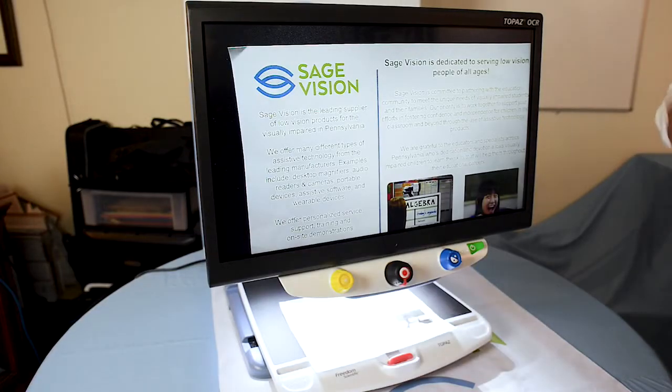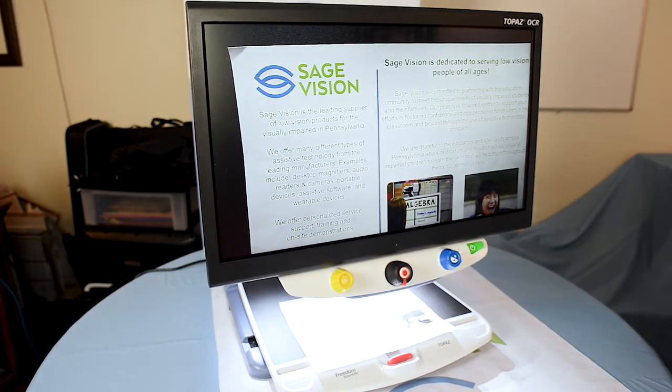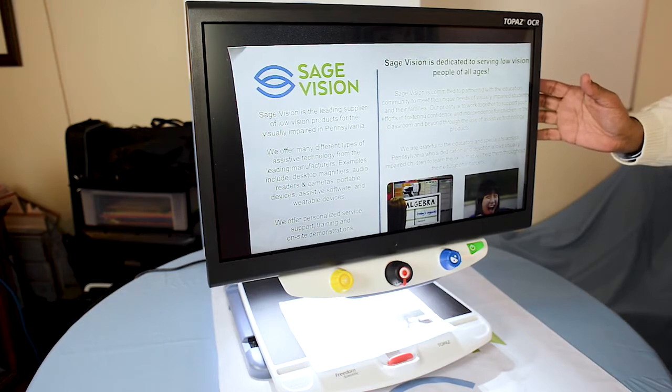This is the Topaz 24-inch OCR by Freedom Scientific. SageVision is the premier dealer in Pennsylvania for Freedom Scientific. I'm going to go into some of the great features of this device.